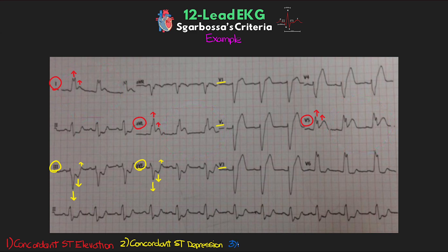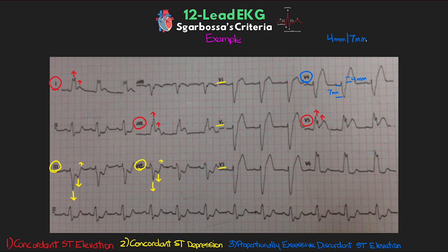Finally, we look for disproportionately large ST elevation when comparing that to the amplitude of a negative S-wave. Let's look at V4 — hopefully this one really stands out. If we measure our S-wave, it's about 7 millimeters deep. Looking at our ST elevation, if we estimate our J-point to be right about here, we have about 4 millimeters of height. So if we divide our ST elevation of 4 by our S-wave amplitude of 7, we get 57%, which is way above our criteria of greater than or equal to 25% in at least any one lead. At this point, we can say that this patient is having a STEMI.